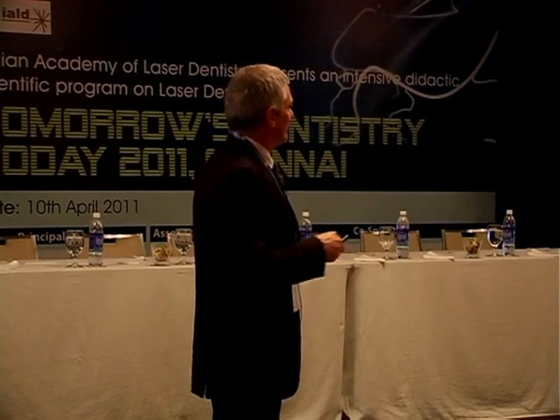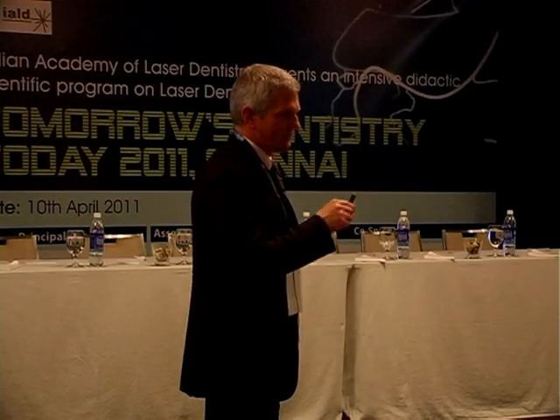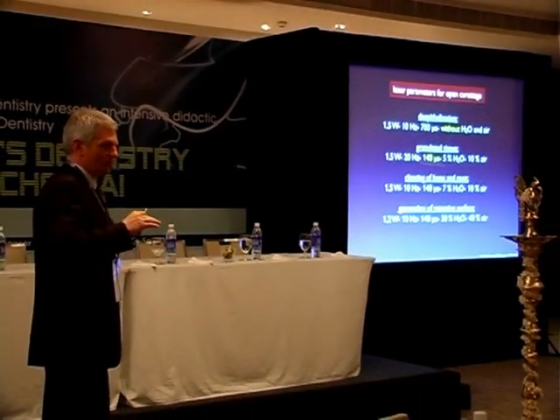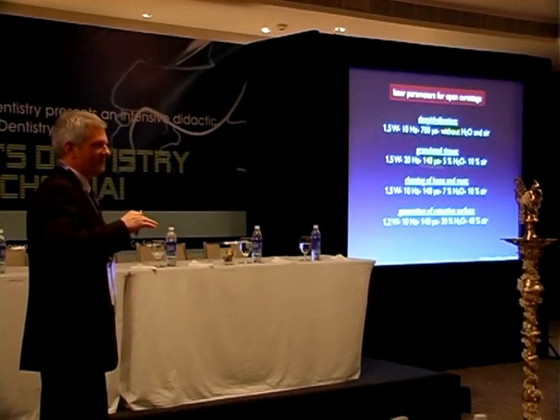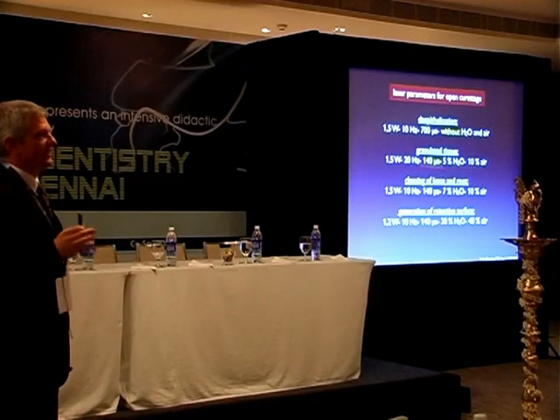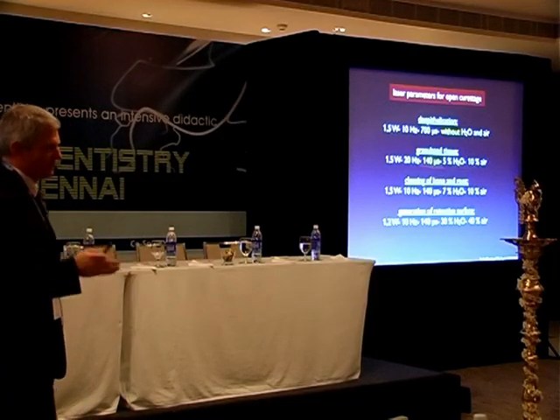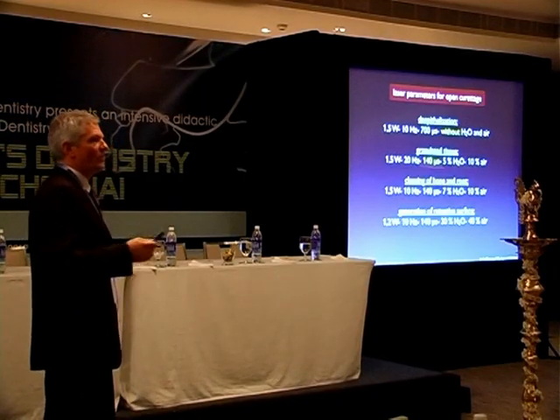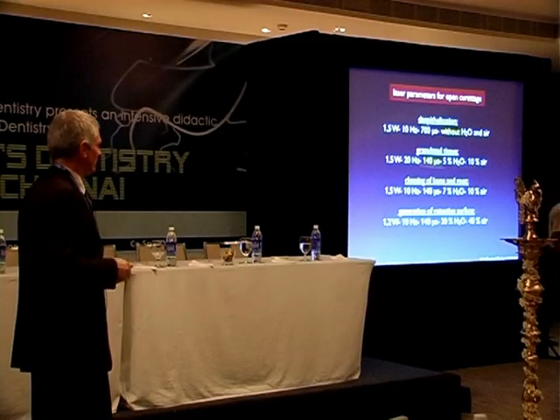Periodontology. If you use lasers in periodontology, the erbium laser is only suitable for open curettage, because the erbium laser is ablating hard and soft tissue. So if you use it in closed curettage, you cannot control what the laser is removing. Therefore, it's recommended that you only use erbium lasers in open curettage, so you can see what you are ablating. With diode lasers, it's different. You can use them in open and closed curettage.